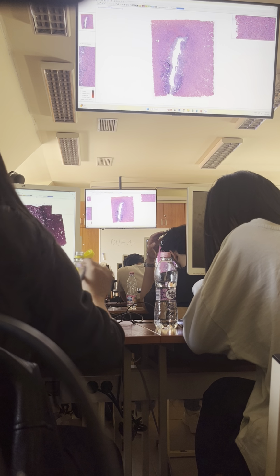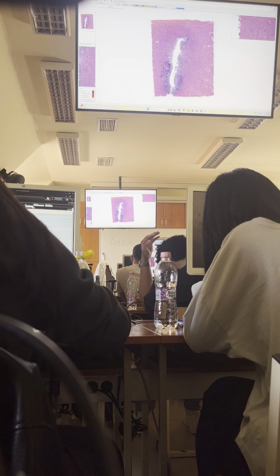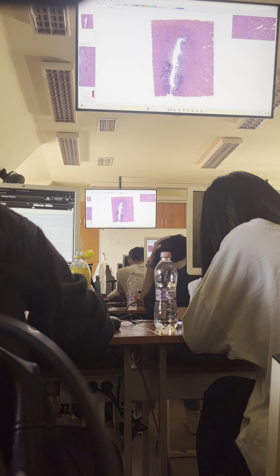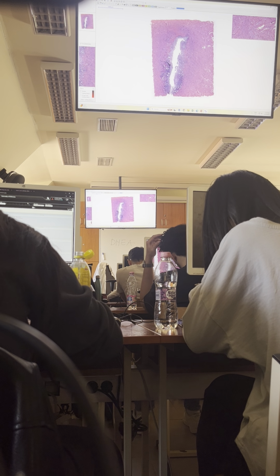And in other organs we would call it external muscle layer, but here we don't use this terminology. Instead we use myometrium as a name. So this muscular part of the wall is the myometrium. Entirely smooth muscle, it can be divided into 3 sublayers.